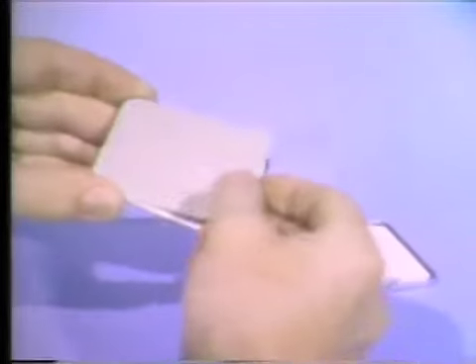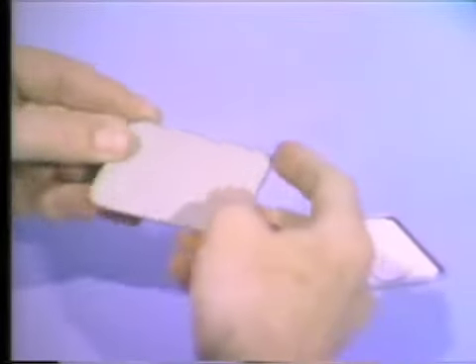For this procedure, we must use another method of film packaging to reduce the exposure of the patient. The film has an emulsion on both sides and has been cut from a large-size screen-type film. Films from an occlusal packet are not suitable.